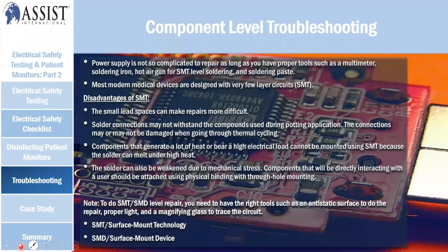So you need proper tools to work on this kind of device, especially when you do SMD level repair. You need a heat gun, SMD removal tools, an anti-static surface to do a proper repair, and proper lights, because if you don't use proper light, it can damage your eyes as the components are very small. So always be careful when you deal with SMT circuits. Surface mount technology is a newer feature. Every electronic board you see has these parts, and it's becoming smaller and smaller day by day.